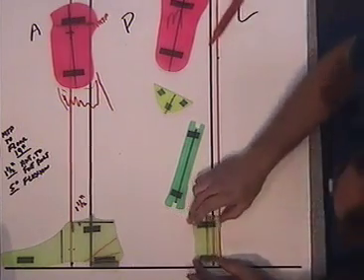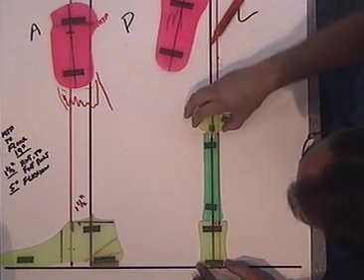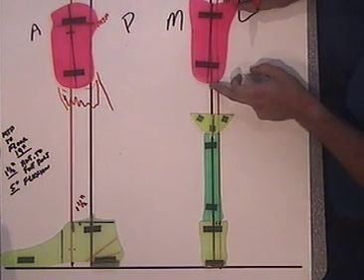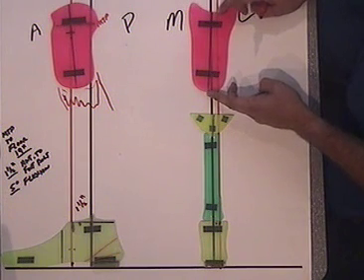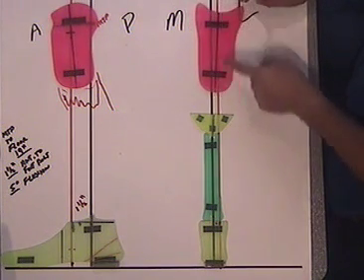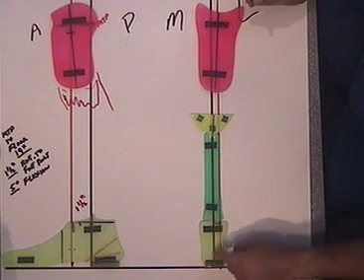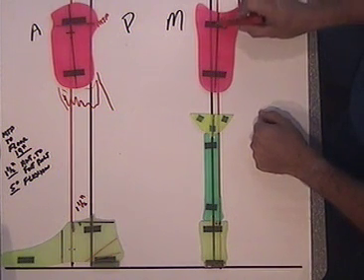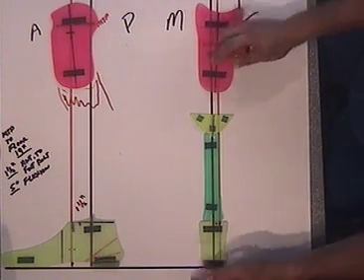Well, 1/2 inch. So I'm going to go ahead and just place these back on the paper here, and then we're going to adduct this 5 degrees, and then we're going to slide it lateral like this. So it's 1/2 inch outset to the center of the heel back here. You can also use the center of the ankle bolt. Either one, center of the ankle bolt, center of the heel, works out pretty well. So if we just drop this line down, the socket is now outset 1/2 inch from the foot. So the foot is closer to the midline.